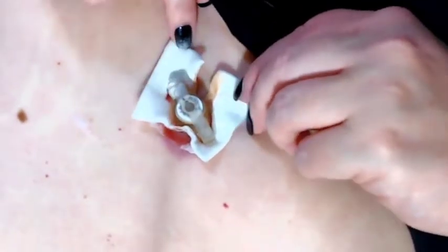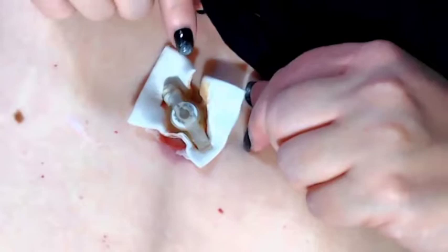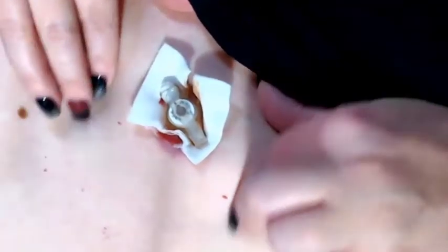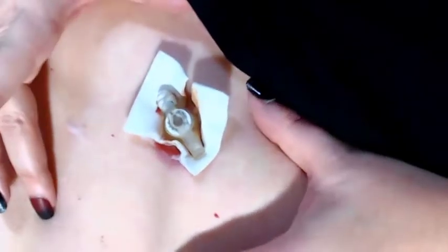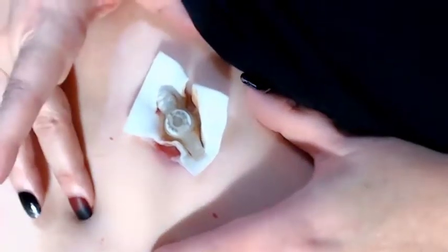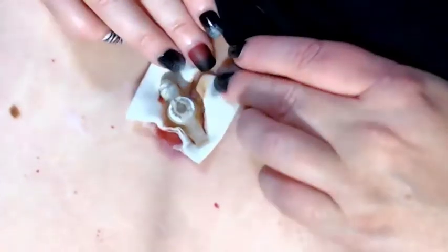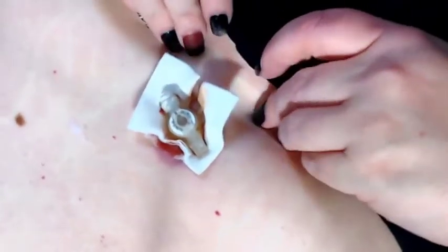This is just a 2-inch gauze and is normally reserved for using with babies and small children that have feeding tubes. Normally, they give an adult a 4-inch gauze, but I find that if I don't tape it down, then it just folds up and gets in the way, and I don't like the tape because it irritates my skin.